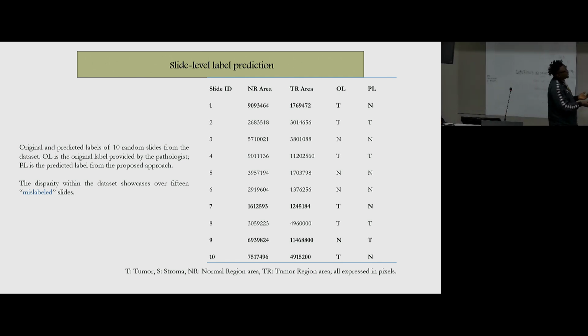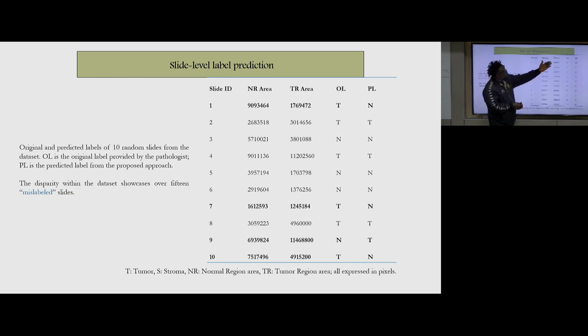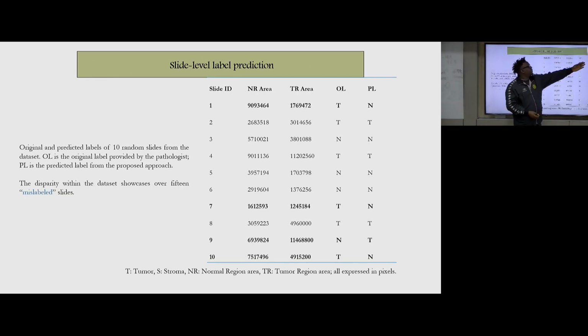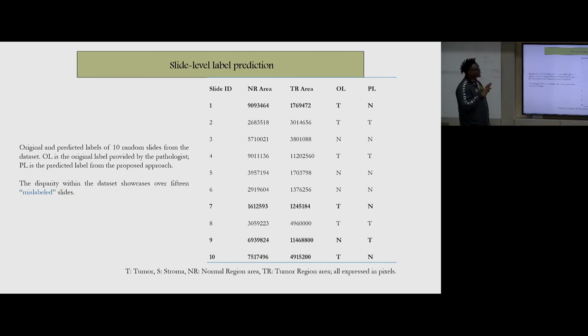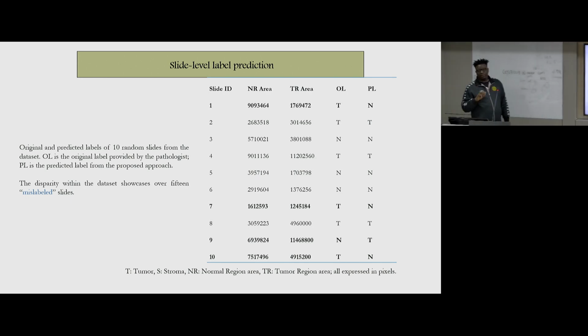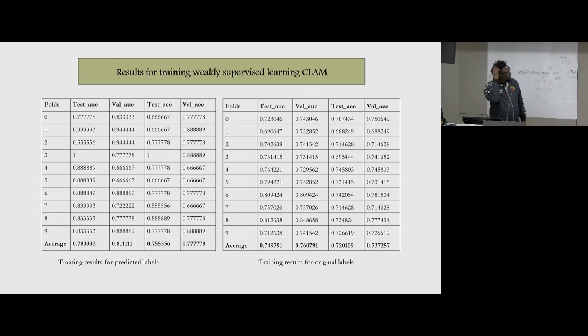But at the prediction here, with the model, the segmentation EfficientTransUNet, we see that when we compare the pixel area by majority voting, we have some different levels. So in this sample, we have 1, 2, 3, 4 that are different. In 88 slides, 15 were different. It therefore means that I have to do some training.